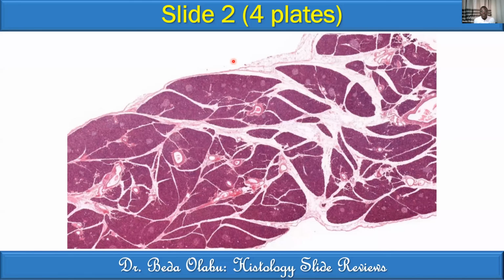Then I'm going to give you a second level of magnification. Then you write down something as well. And then the third one and the fourth one lastly. You don't have to write long sentences. Remember, you are the one going to use this as a reference. Just mark yourself. So you just write down what stands out, 1 or 2 words for each point.